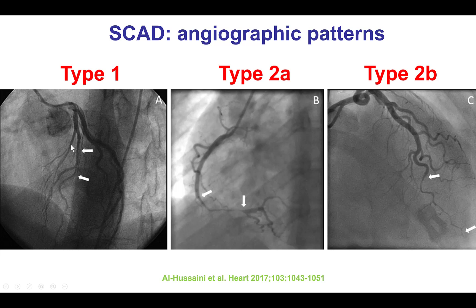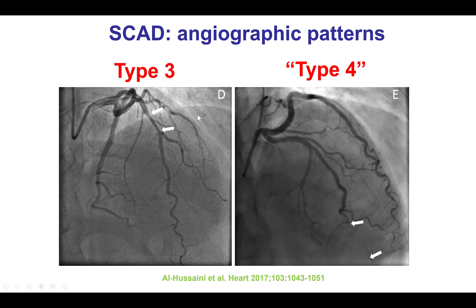These are some examples: type 1 SCAD with a radiolucent segment in the mid-LAD; type 2A, in which there is diffuse narrowing of the distal right coronary artery with normal-appearing vessels more proximally and distally; type 2B, where there is diffuse stenosis all the way to the end of the vessel; and type 3, which appears as a more focal tubular stenosis. There has also been a proposal for type 4 SCAD, in which there is occlusion of the vessel distally that subsequently spontaneously re-canalizes, in patients in whom embolism has been excluded.